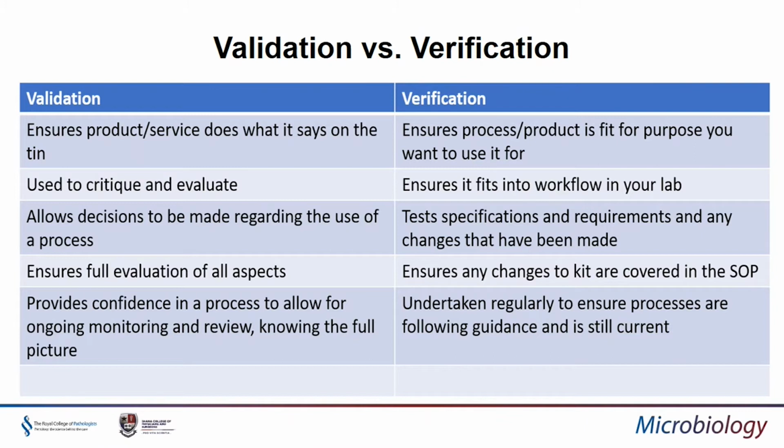So you're looking at workflow and where does it fit in with turnaround times? Where does it fit in with whole laboratory work? And it also provides confidence in a process to allow for ongoing monitoring and review, knowing the full picture when you've done a full evaluation of the product.